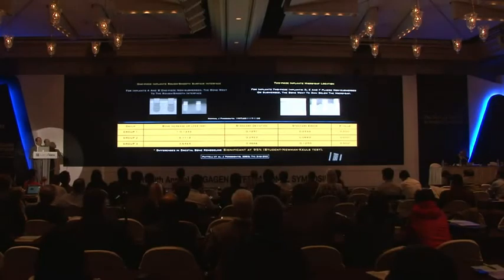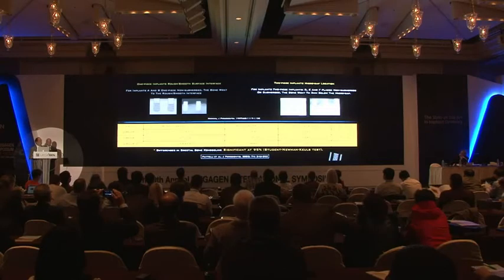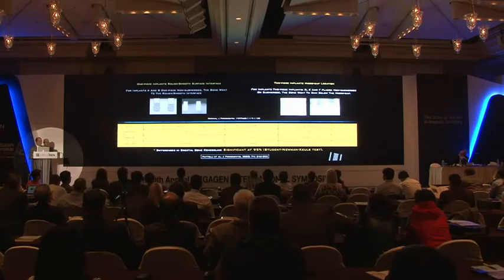In the 2-piece implant, the classic Brånemark implant, the bone went 2 millimeters below the microgap implant-abutment. For this reason, it makes no sense to insert the implant-abutment connection under the bone, because otherwise we will have 2 millimeters of absorption plus the millimeter that we submerged the implant.